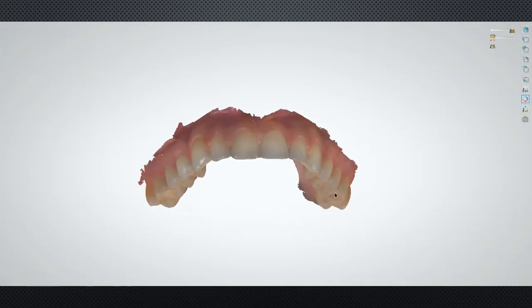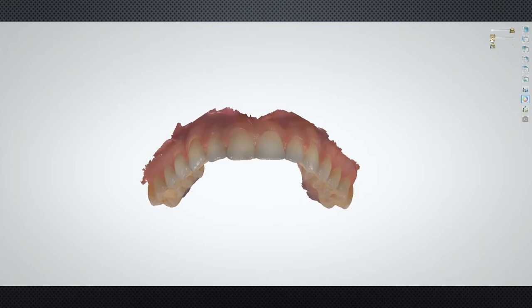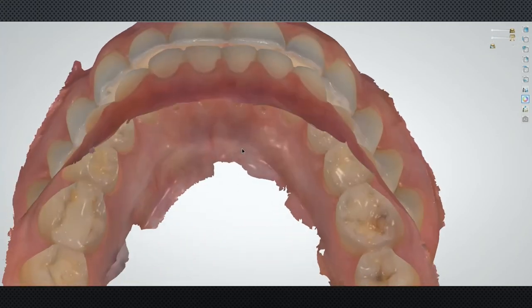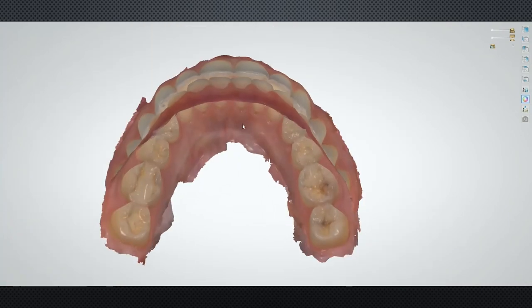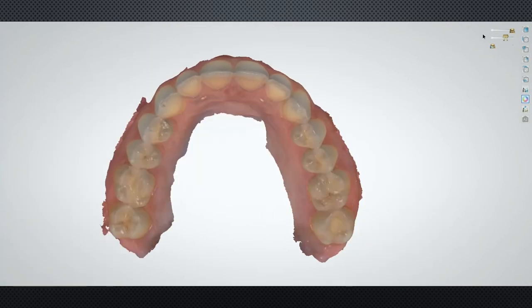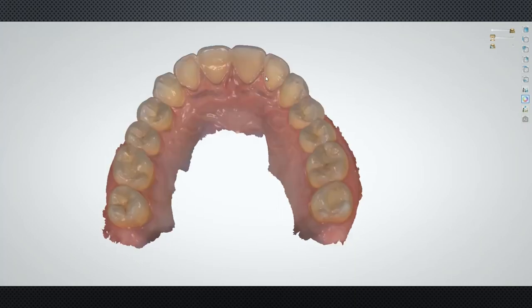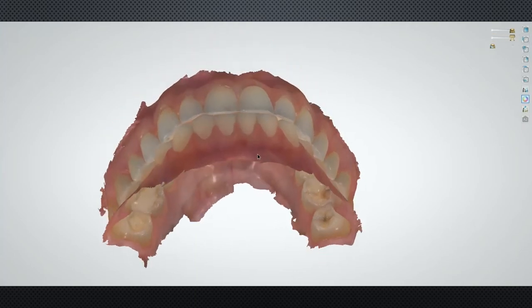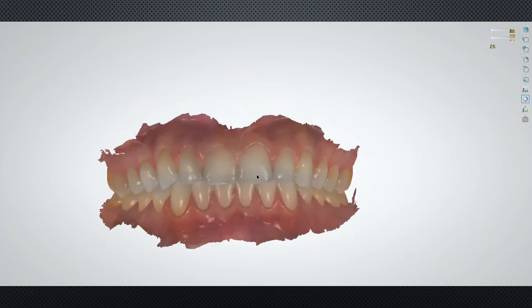So you look at the scan here, and again, occlusion is fine. What do you do? You don't want to do a full mouth opener and have him do composites and open everything up. That's a lot of work, and even for him to do chair side, if I made him a matrix or anything, managing those contacts is going to be very, very difficult. So of course, light bulb moment, you tell him, hey, what if we take clear aligners, and we do some interproximal reduction on these lower anteriors, crank them back a little bit so we get some prosthetic space to do a little bit of lingual veneers there.